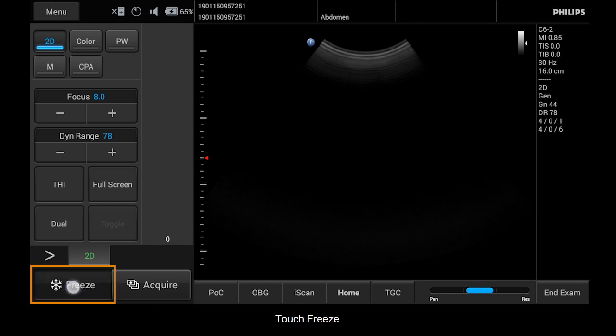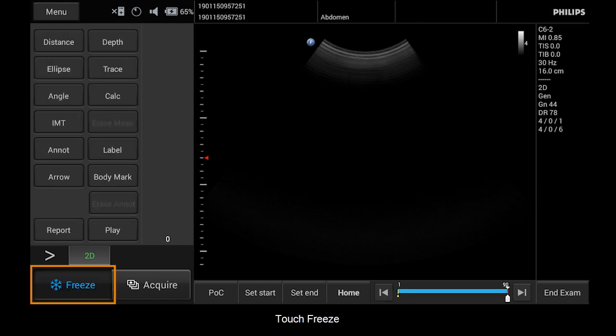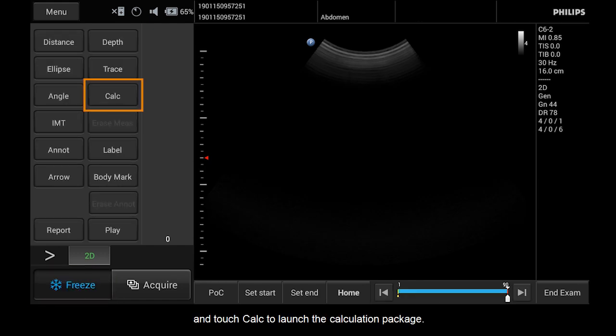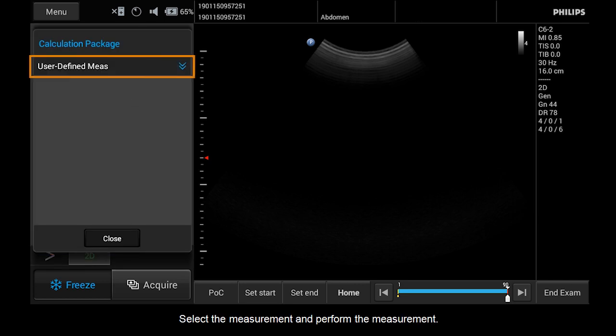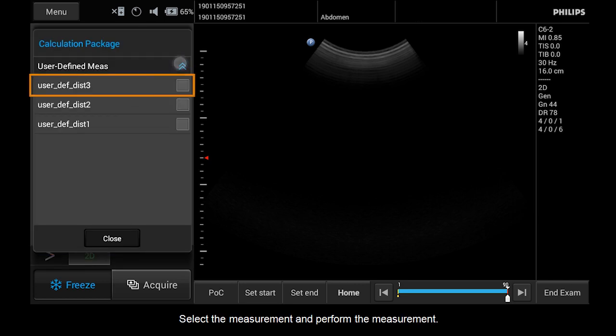Touch Freeze and touch Calc to launch the calculation package. Select the measurement and perform the measurement.